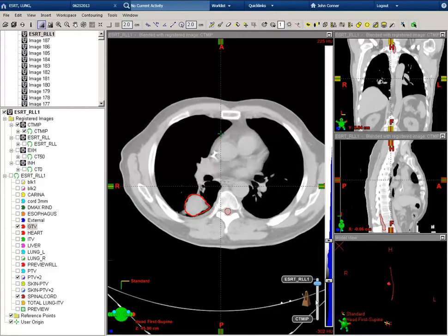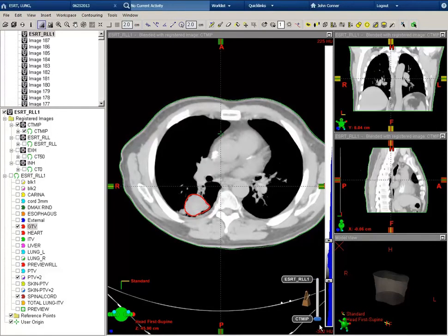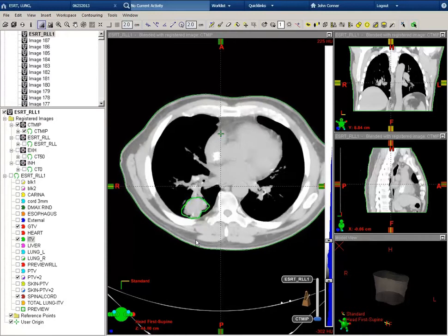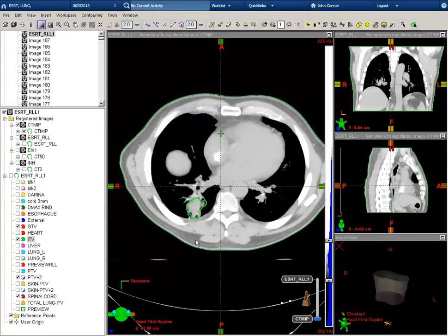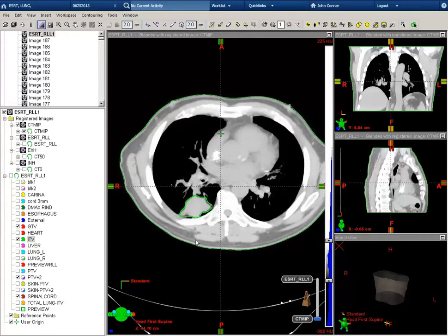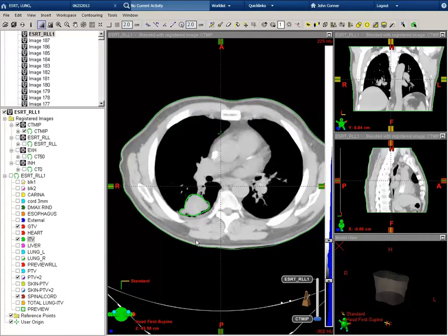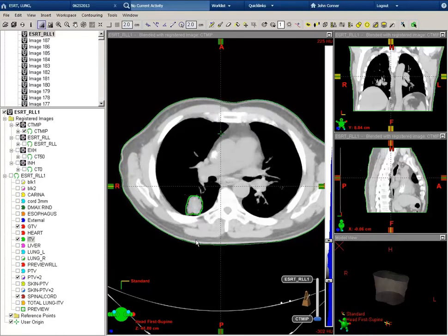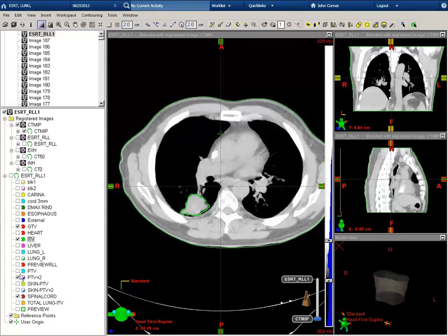Here I can use the slider bar to move down to the CT-MIP, which was fused with the helical scan. The CT-MIP is our maximum intensity projection scan. This shows the tumor in its maximum extent or maximum projection, and it's outlined here in green. This denotes our ITV.